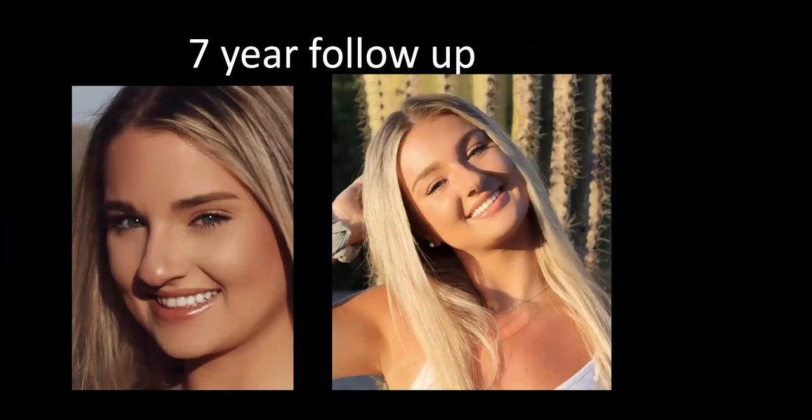One of the interesting things is people are always asking questions about the periodontal health of a case. When the Bioclear method is done appropriately, the periodontists, and there are many periodontists who are working with us with the Bioclear method, their observation has been that the soft tissue health actually improves because we have less food impaction, less area for bacteria to accumulate.